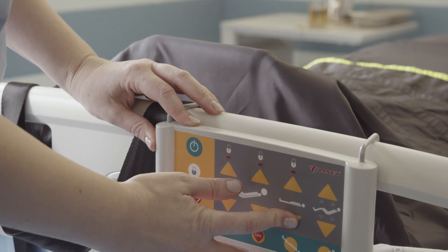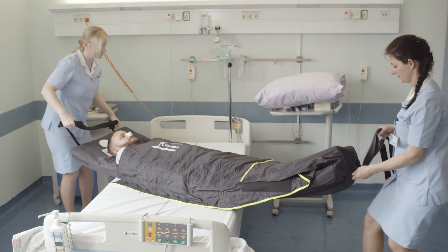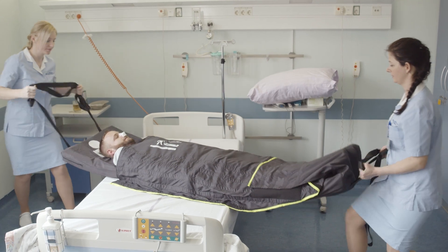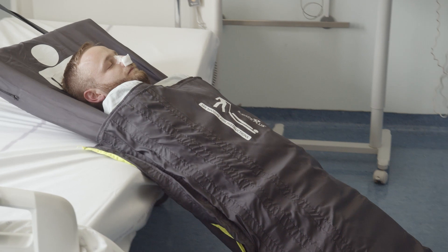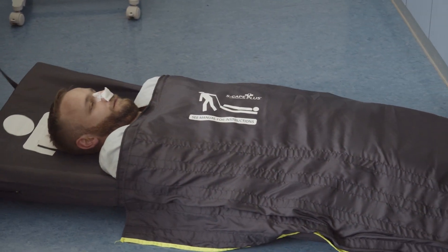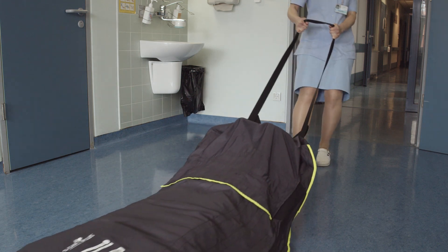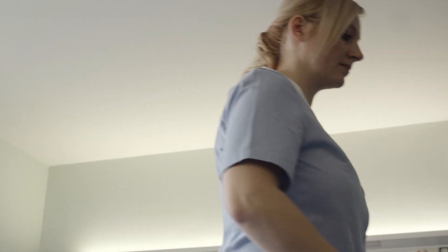Evacuate the patient by pulling the evacuation mat. Hold firmly the belt attached to the feet part of the mat. Stand upright and use your own weight when pulling. The patient can be evacuated by one or more persons. Assisting persons can use the pulling belt at the head for easier steering. Evacuation down the stairs should be performed by two people.